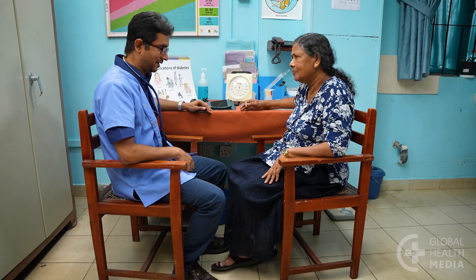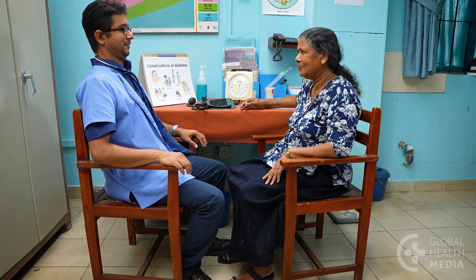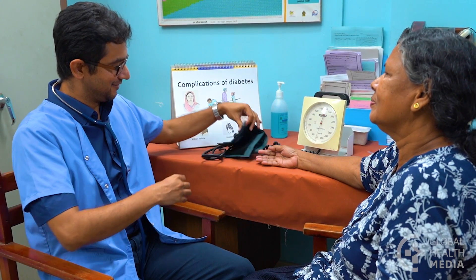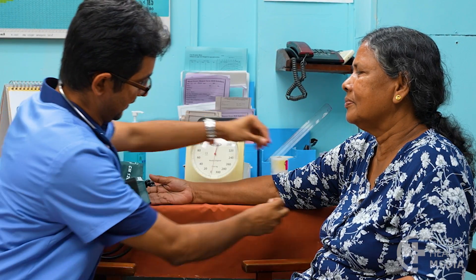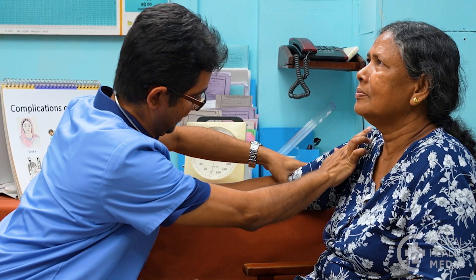The person sits with both feet on the floor and her back supported. The arm is relaxed and at rest. You and the person should not talk during the blood pressure measurement. The upper arm should be bare, though if the sleeve is thin, it will be okay to put the cuff over it.